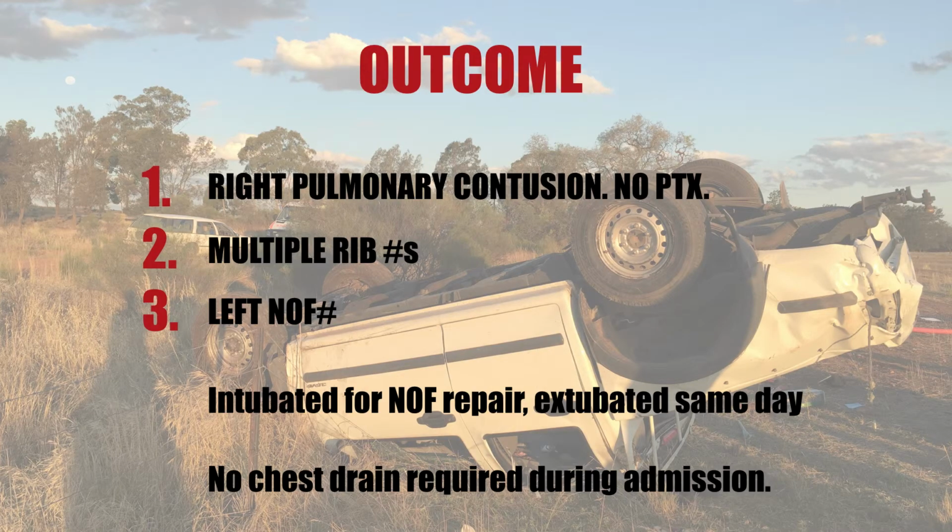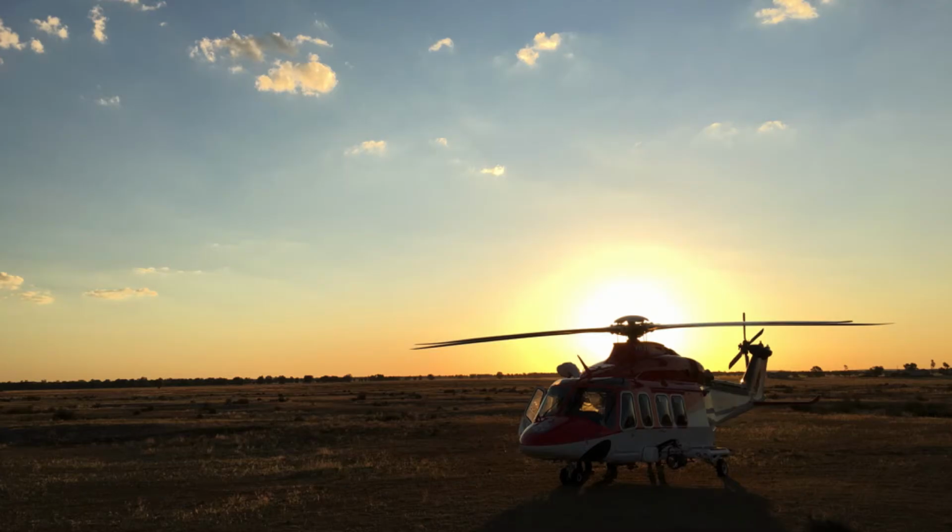So he gets titrated analgesia, and we calculate we have enough oxygen reserve on the helicopter to get him safely, spontaneously breathing to the major trauma centre. Over the next 2 weeks, the only reason for the patient to be intubated was to facilitate his orthopaedic repair, and at no point does he require intervention on that right hemithorax. There is no doubt in my mind that the use of ultrasound on this patient allowed us to deviate our initial clinical assessment and avoid performing what turned out to be an unnecessary invasive procedure.